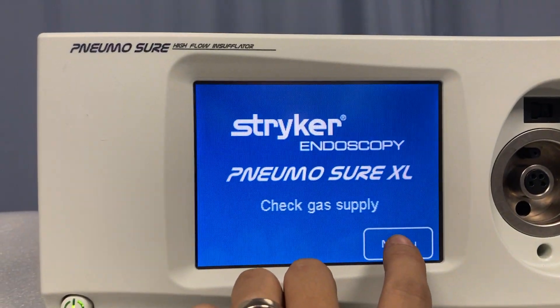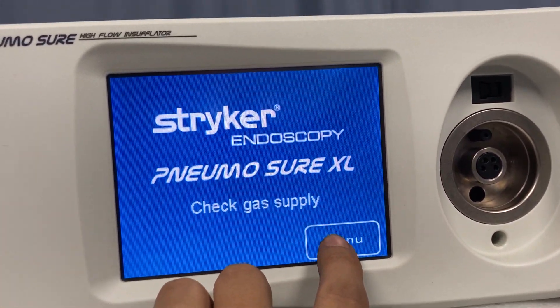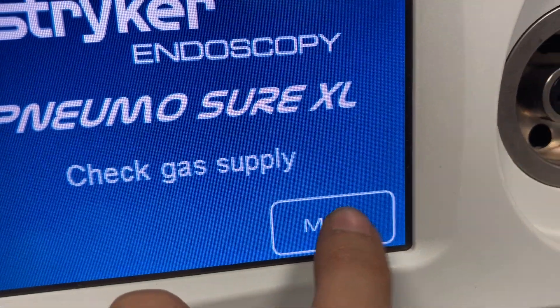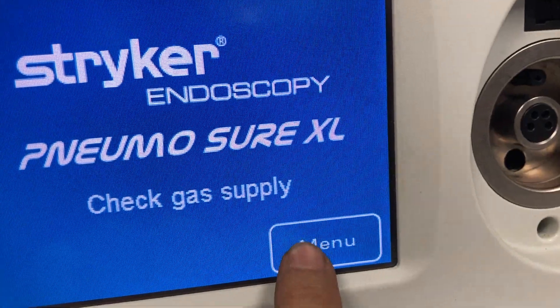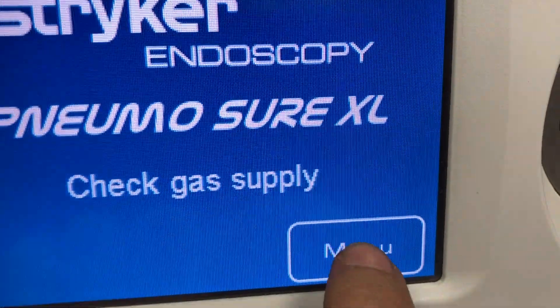Here we have a Stryker Pneumosure High Flow Insufflator. We notice that the screen is responding to the touches but for whatever reason it's not registering the click — or rather it is registering the click, but the menu is not jumping into the menu.